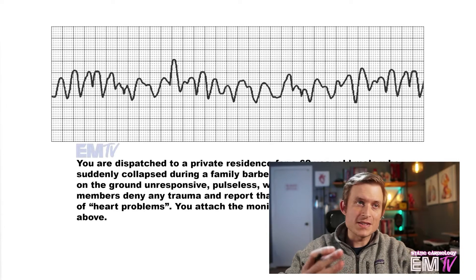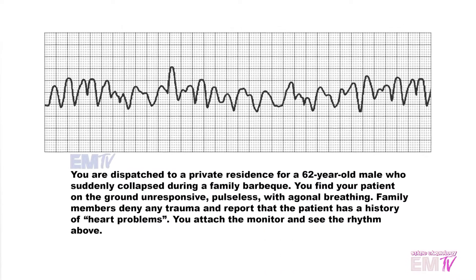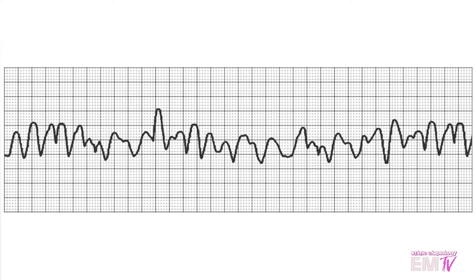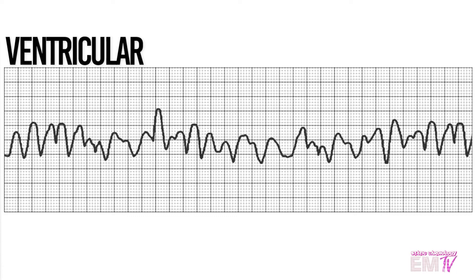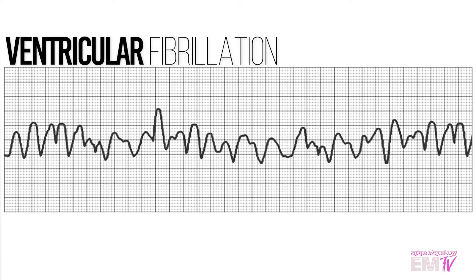Let's go ahead and take a look at the rhythm and identify it. So right off the bat, this rhythm is irregular. It is inconsistent. It is chaotic. There's no semblance of any sort of organization. There aren't any P waves, QRS waves, or T waves. All you're seeing here is a wide, chunky, chaotic waveform. The only waveform that looks like this is going to be ventricular fibrillation, or V-fib.